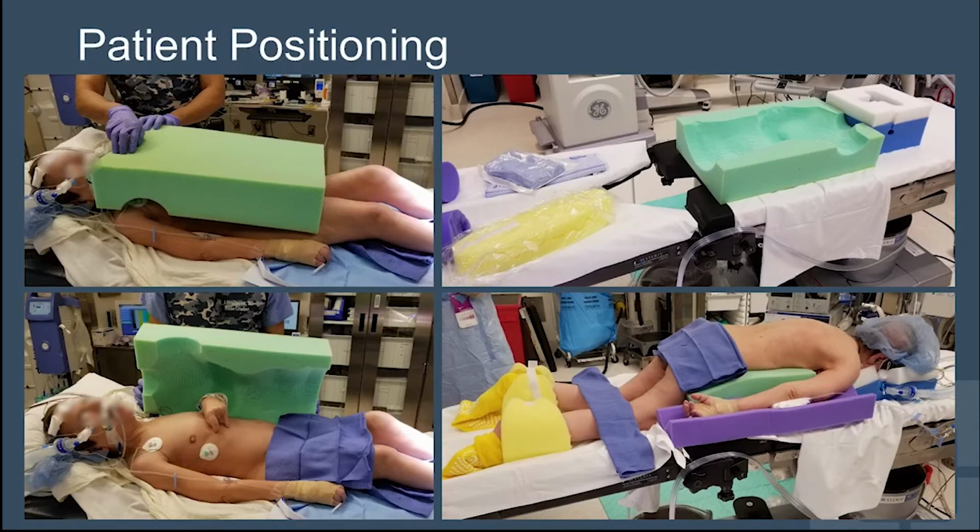Small adjustments are easy to perform in the operating room as the foam is easily cut to allow for last-minute modifications. In this case, the only modification that we made was cutting a small amount of extra space for the anesthesia headrest at the patient's neckline.